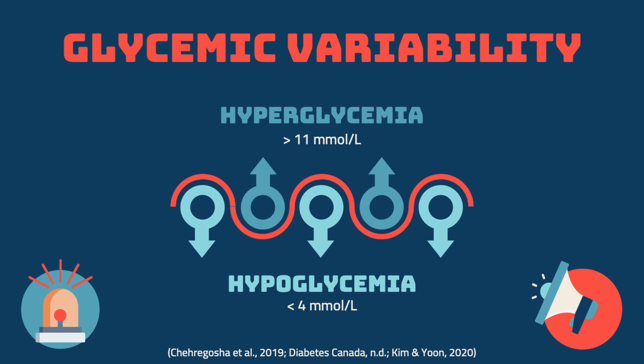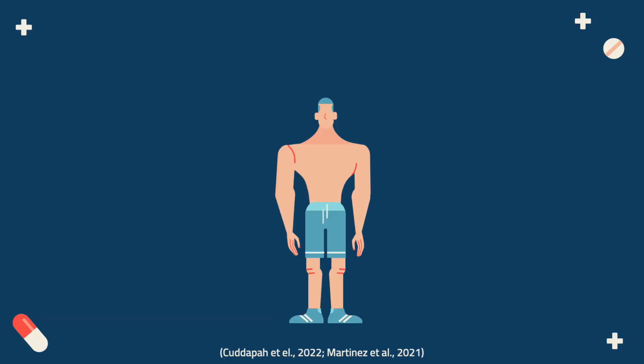Continuous glucose monitoring is often considered for patients with severe or nocturnal hypoglycemia and those with hypoglycemia unawareness, as device alerts are transmitted to the individual or a designated carer to prevent life-threatening events.